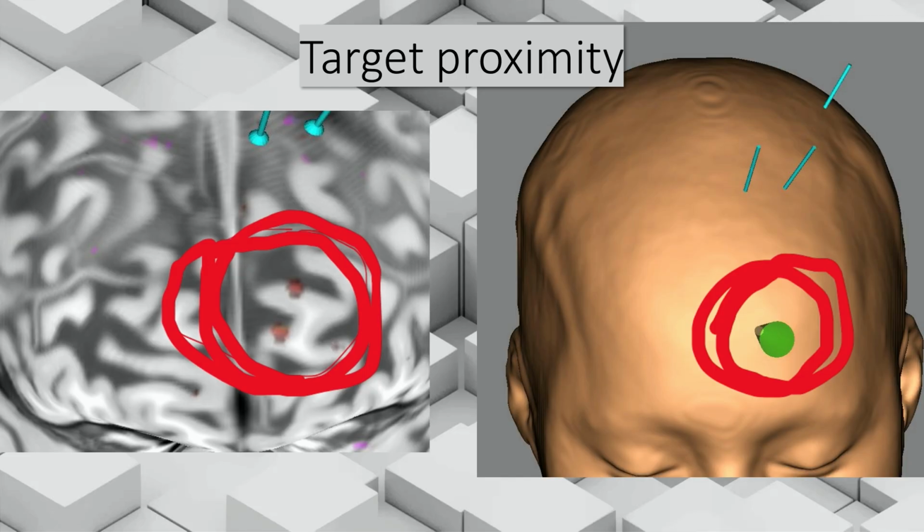If you have a choice, knowing that that's going to sting pretty badly and some patients are really not going to tolerate it very well, say multiple connectivity blobs that are homogeneous, look pretty good, close to the scalp surface, and you want to stimulate them, having a backup target is not a bad choice.